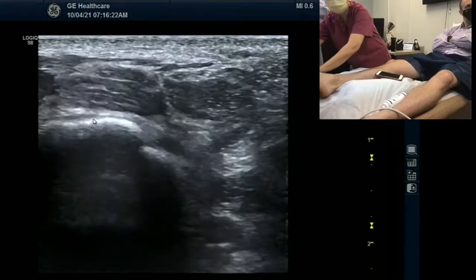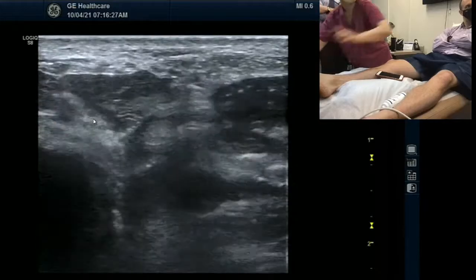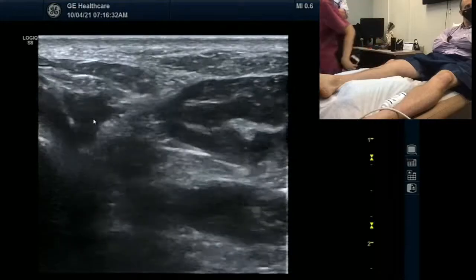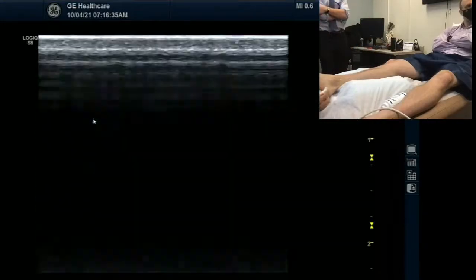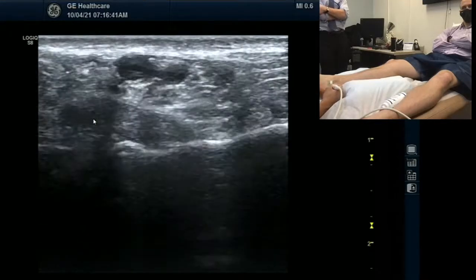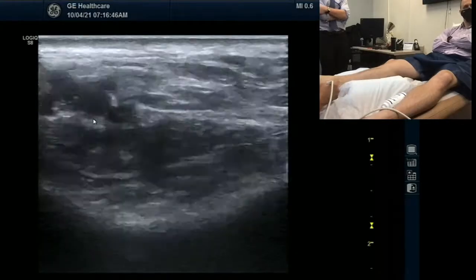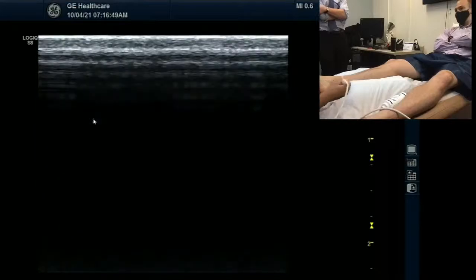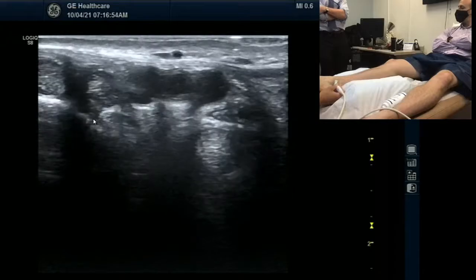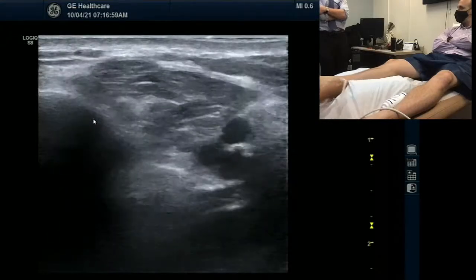Stay here. Flex your big toes. So it looks like this is a flexor hallucis. It's difficult. Another thing I can do, if we want to confirm, is I can look at the knot of Henry. And then go from there. Please elaborate for our viewers. What that is. So the knot of Henry is a common point of intersection syndrome at the bottom of the foot, usually with the flexor hallucis longus and a flexor digitorum longus crossing.